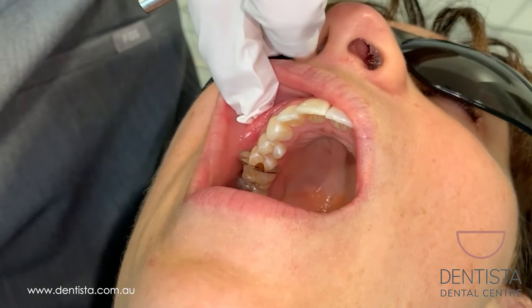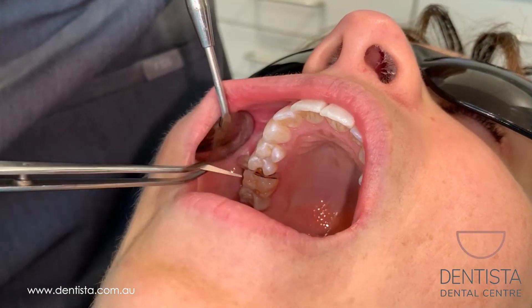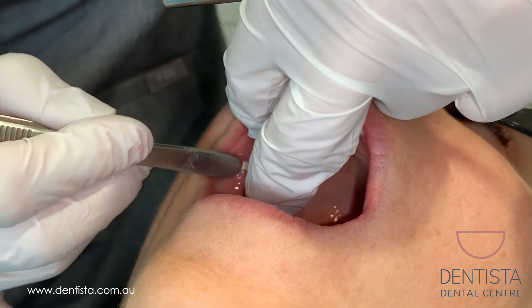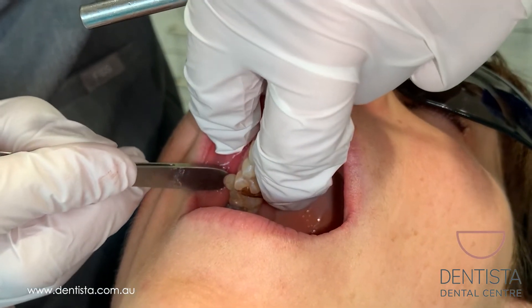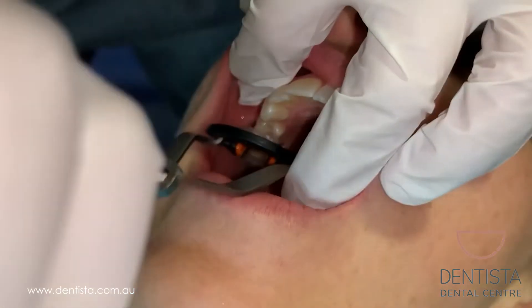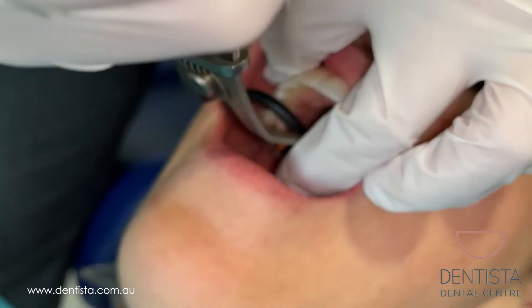Erin's cavity is between her teeth. If we were to just put the filling in it would spread out everywhere and she wouldn't be able to floss properly and food would get stuck. So what we're doing here is using something called a matrix. It forms a barrier and a nice shape so that when we put the filling material in it's the exact shape that we want, so food will not get stuck between her teeth and she'll be able to floss nicely.